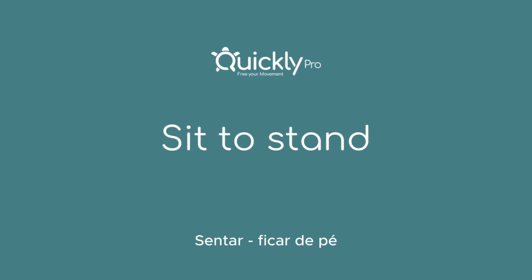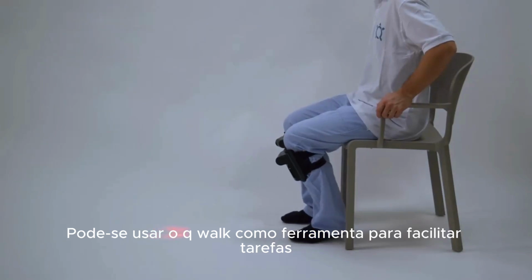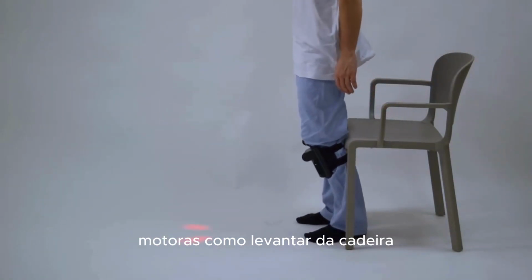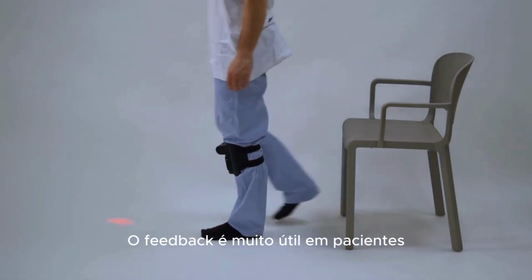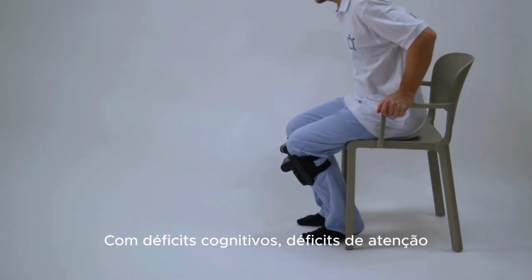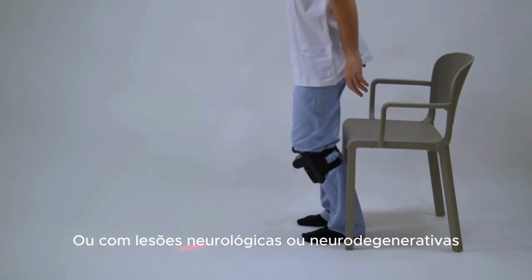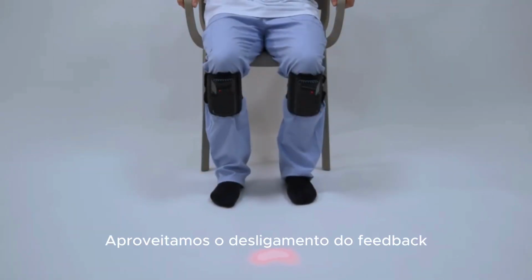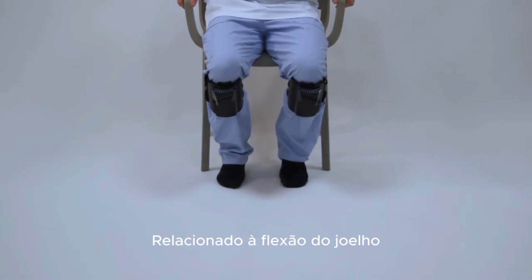Sit to stand. You can use Q-walk as a tool to facilitate motor tasks, such as getting up from your chair. Feedback is very useful in patients with cognitive deficits, attentional deficits, or with neurological or neurodegenerative lesions. In this exercise, we take advantage of the feedback switch-off related to knee flexion.